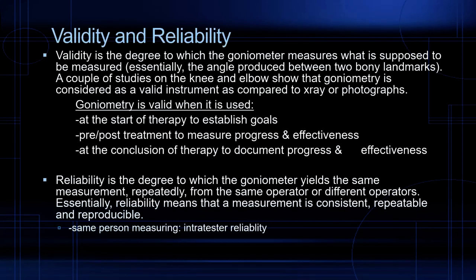Now, you are going to see different ways to measure joints in clinic versus what we teach you in lab. What we teach you in lab is the standard, and it is valid when you're using the same standard. I will tell you straight up, there are ways that I measure in the clinic that are faster and quicker, and I don't follow what is listed in Clarkson all the time. However, to learn, and as you are first starting, I need to have you always go with the pictures and the examples that are laid out in Clarkson.